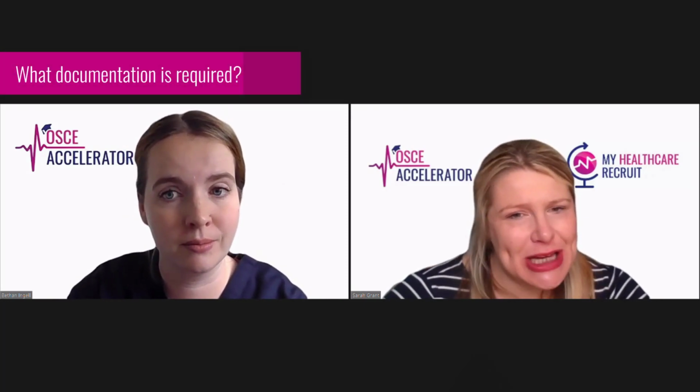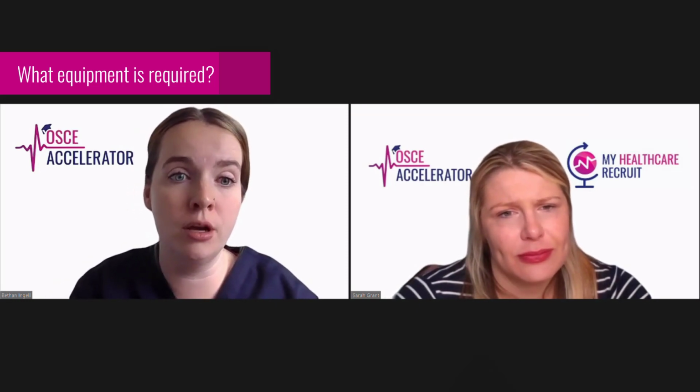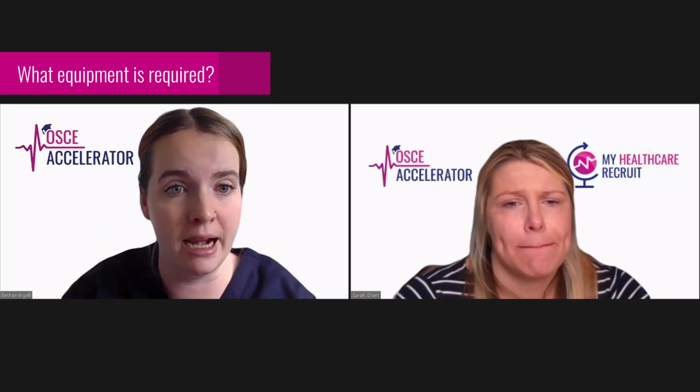And how long on the clock for this station? It will be 12 minutes. Any documentation to complete at this station? Yes, so it's just a simple drug chart, so it's quite straightforward, to say that you have administered the spacer inhaler. And equipment-wise, what might an international nurse be expected to interact with at this station? So you'll have a mannequin which will be either sat up in the bed or in the chair. You'll have your inhaler, obviously, and your space chamber. The space chamber is the same one that we're using for pediatrics or with people who have poor dexterity and they can't press the inhaler themselves.